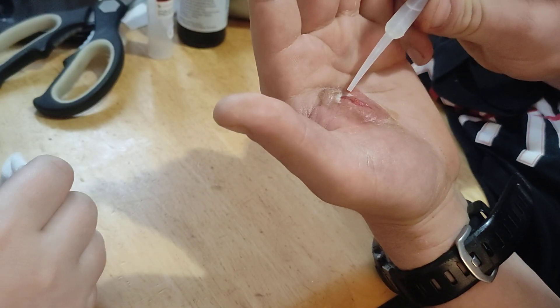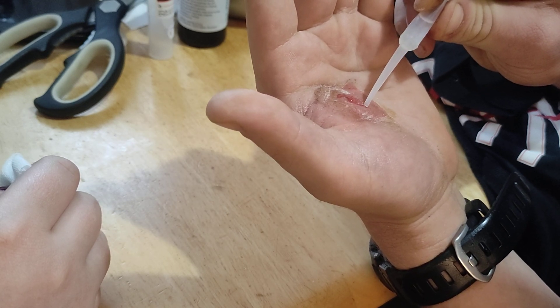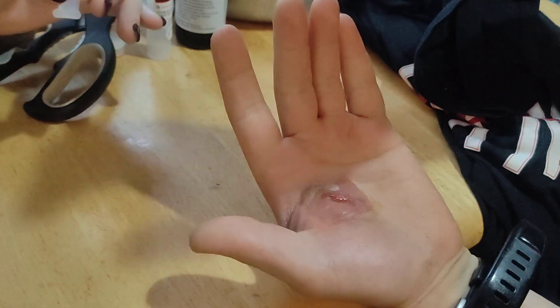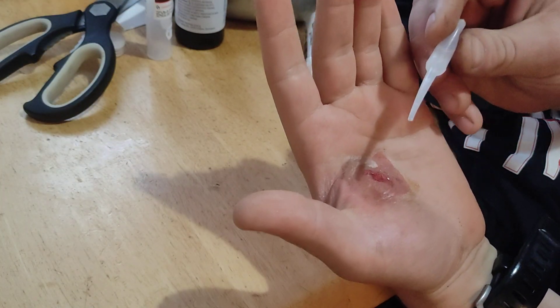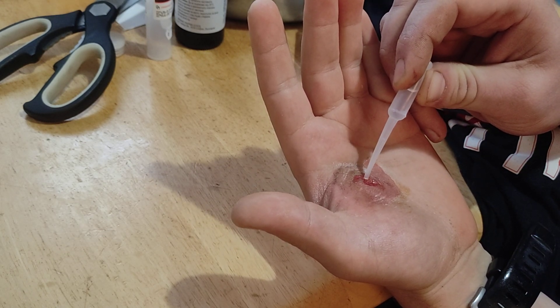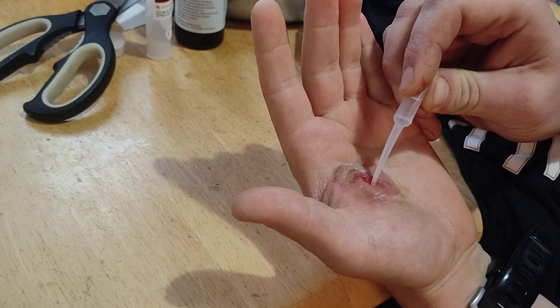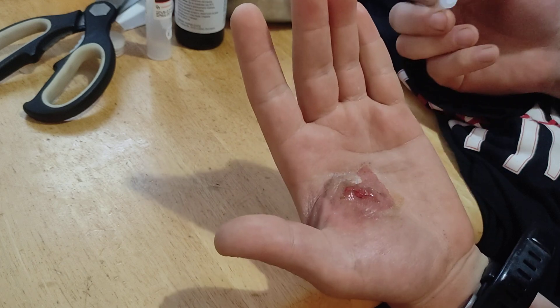I'm putting another layer — it's okay. One straight line? Yes. It's a bit overflowing, a little bit. Another 60 seconds. And one more last layer of glue. There we go. Job done.